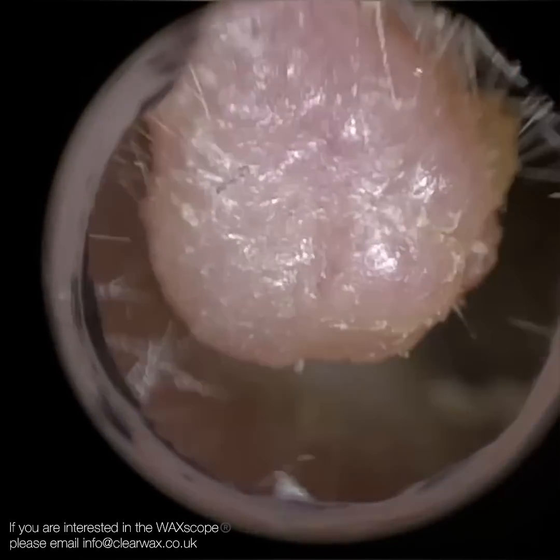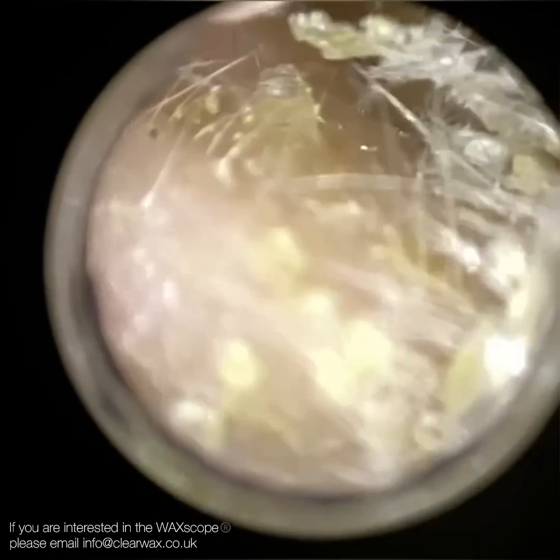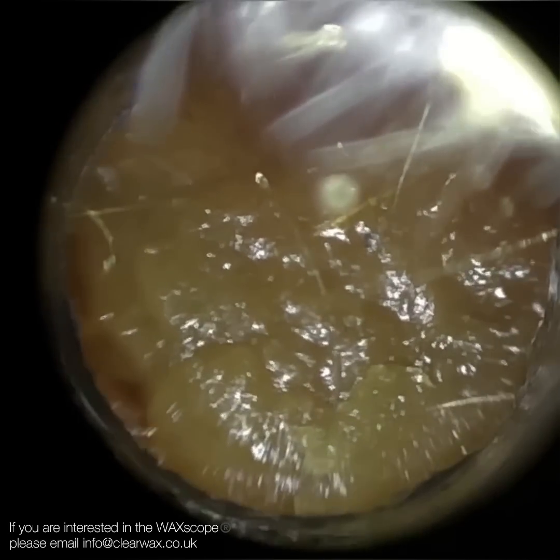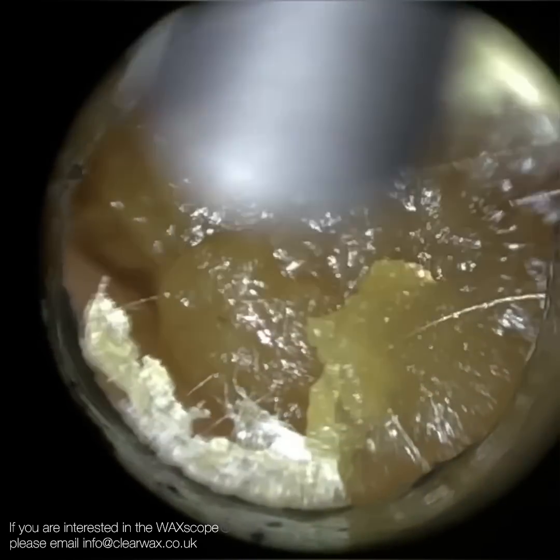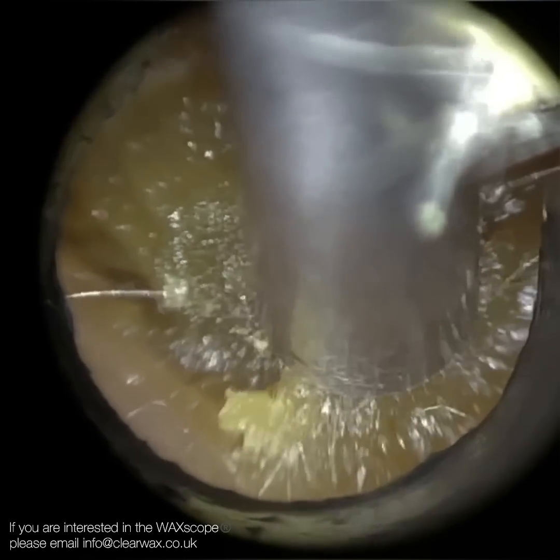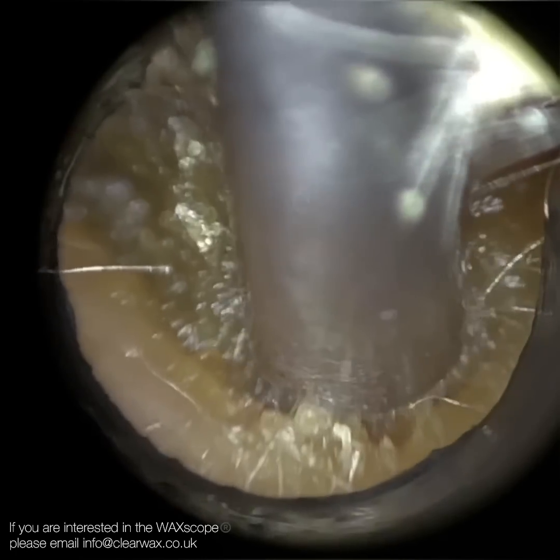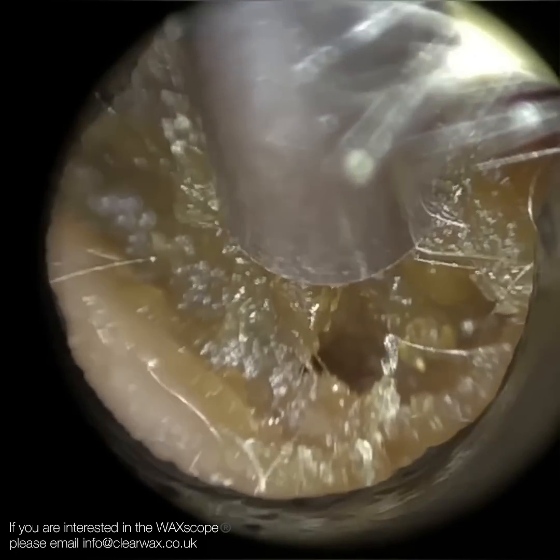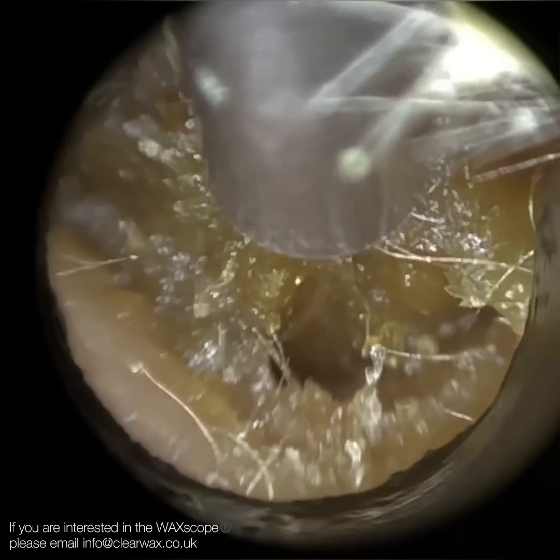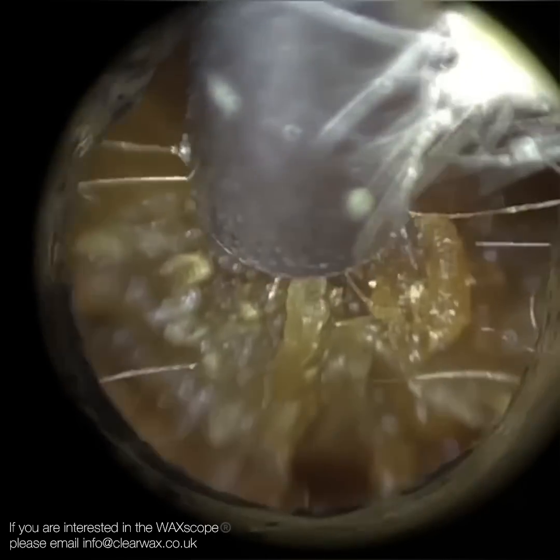Thank you for joining me in this very interesting case where I use the Waxscope and the iClearScope in tandem. You may have seen that this patient presented with a very lateral aural polyp. It may just be a fibroepithelial polyp, or possibly a keloid, but it looks a bit too rough. It's not moist or damp so it's not discharging, but with any form of skin tags or polyps they do need to be investigated further to ensure they're not malignant.